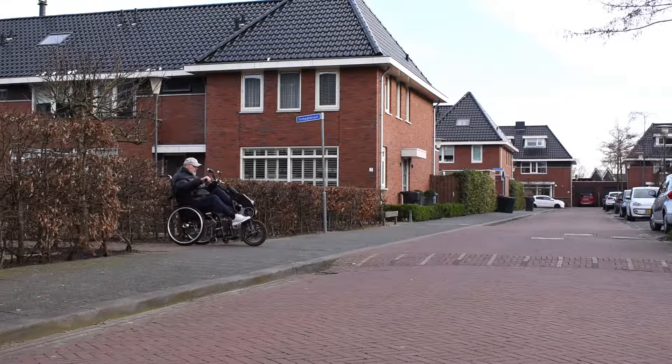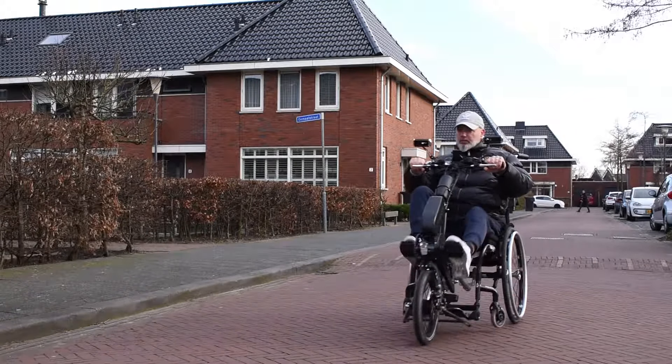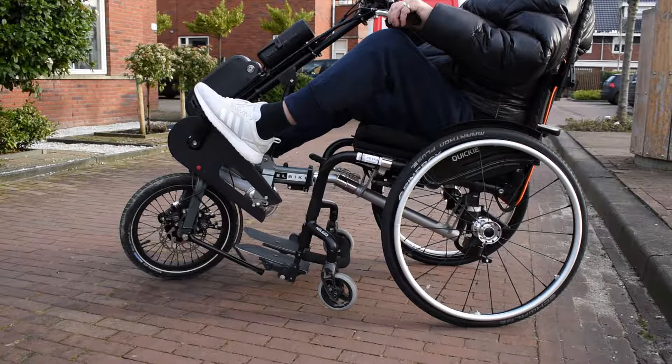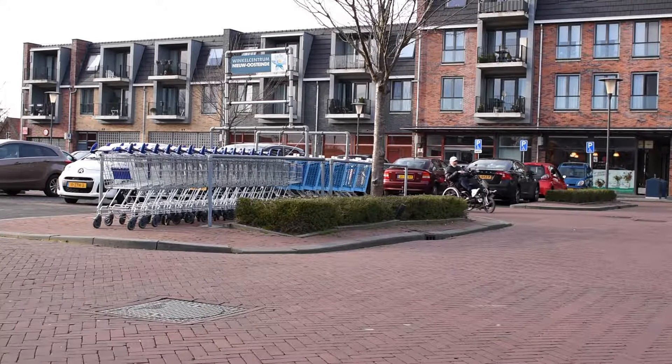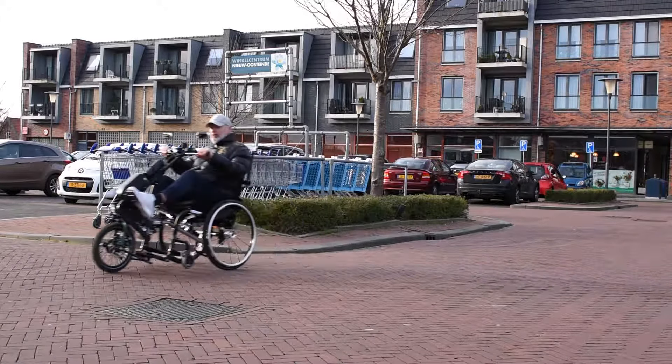The EasyLegs has two models: the EasyLegs Pro and the EasyLegs Connect. This video is about the EasyLegs Connect. The EasyLegs Connect is a one-wheel drive to attach to your wheelchair. In this way, you transform your wheelchair into a tricycle, which is driven by the force of your legs.